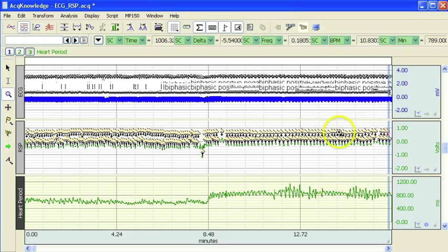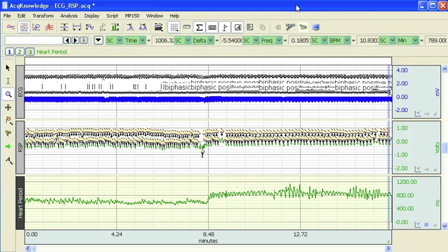That concludes this demonstration of the acknowledged respiratory sinus arrhythmia analysis.